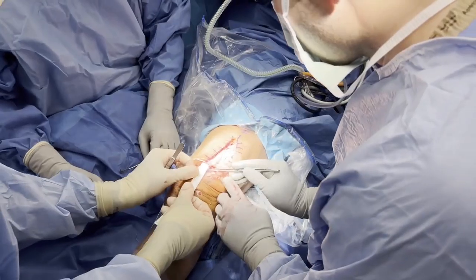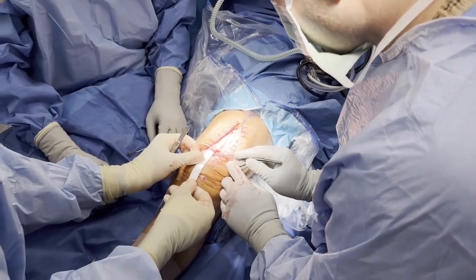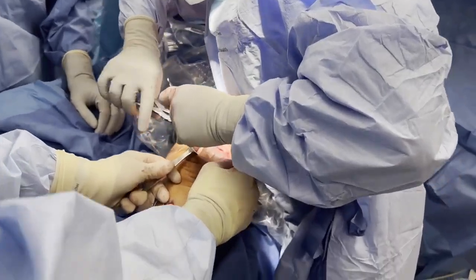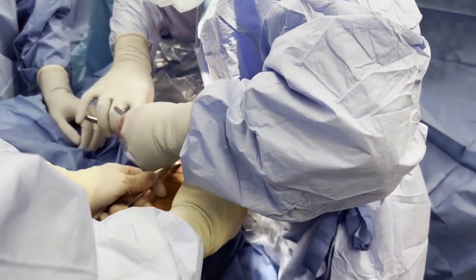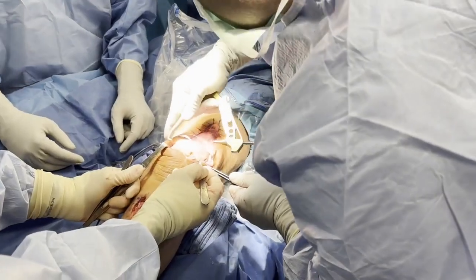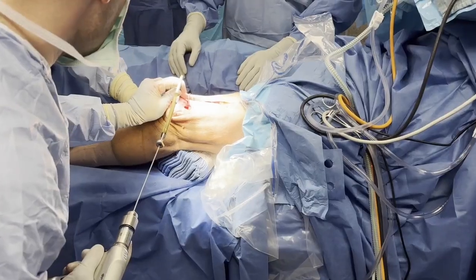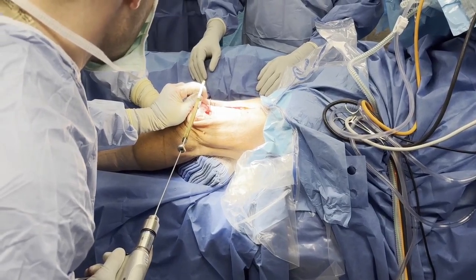A spinal needle is placed at the inferior pole of the patella, and a ruler is used to measure the midpoint of the patella. A rongeur is then used to decorticate the medial and lateral aspects of the patella. An ACL tibial drill guide is used to assist in drilling a guide pin, lateral to medial, through the patella at the previously identified midpoint.